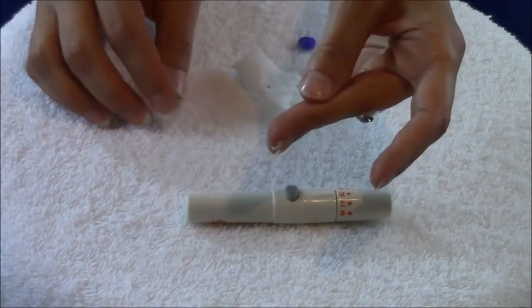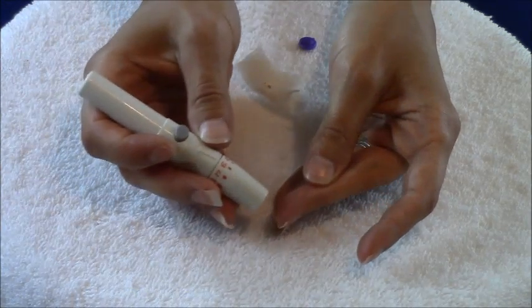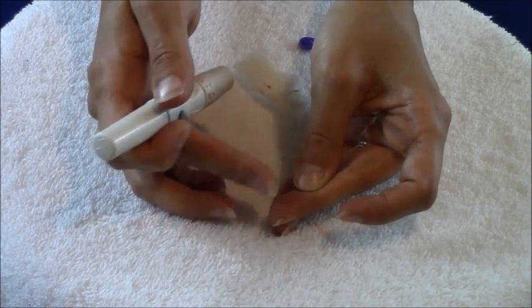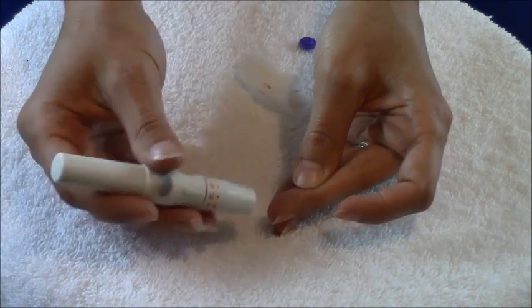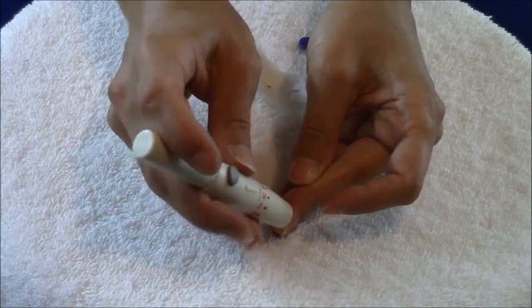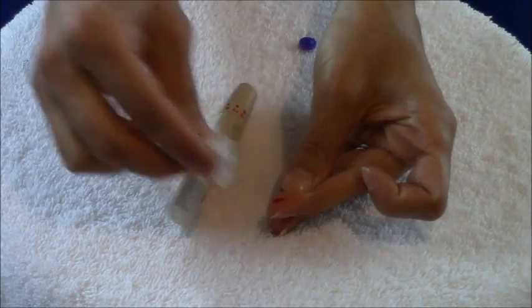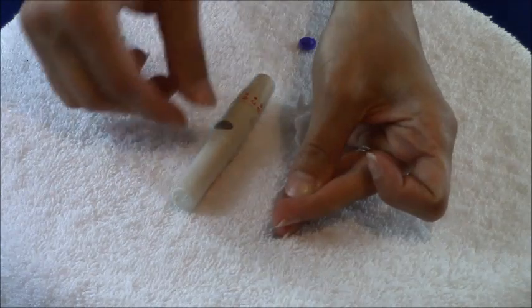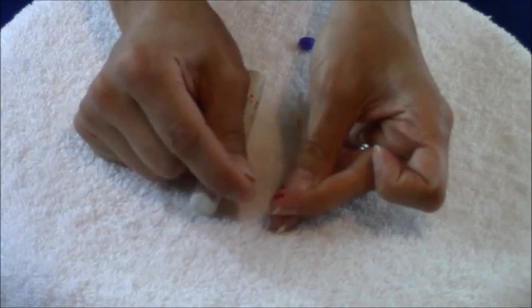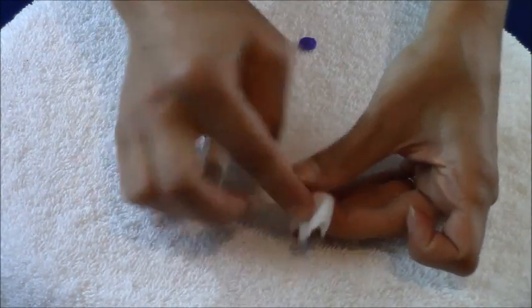Let it completely dry. Then go in at the side of the fingertip — not the middle or the top — because the sides have the best capillaries for getting your specimen. Make firm contact and press it down firmly so you don't go superficially and have to poke the patient again. Hit the needle, then squeeze and wipe off that first blood drop because it's diluted with alcohol prep. Squeeze again, and when you get a good drop take your strip from the glucometer — it will suck up your blood — then put a gauze over and hold, and wait for your result.